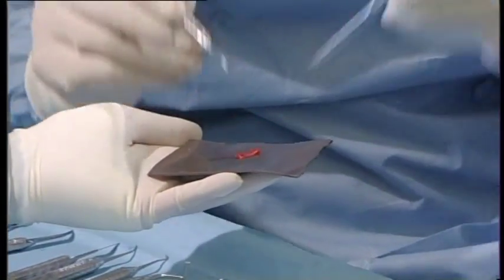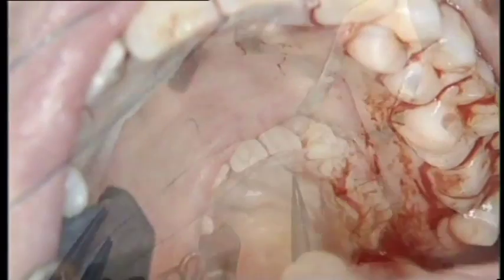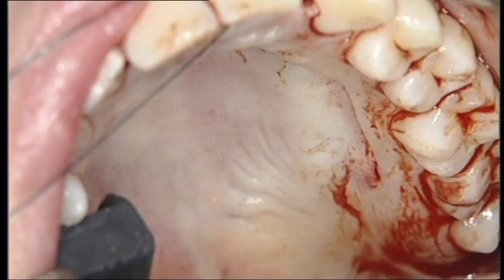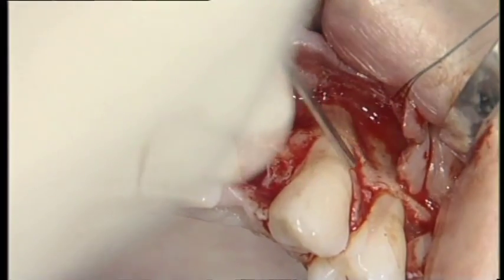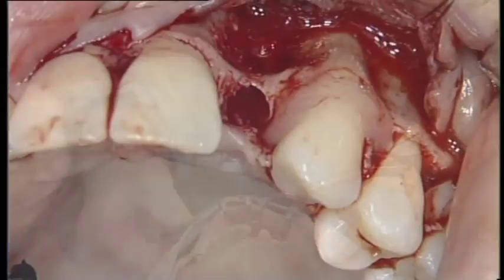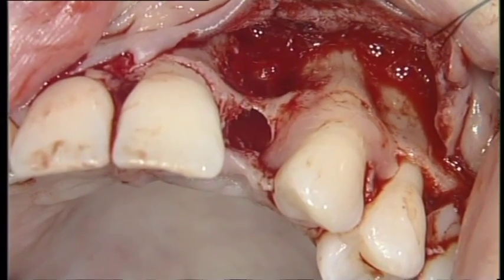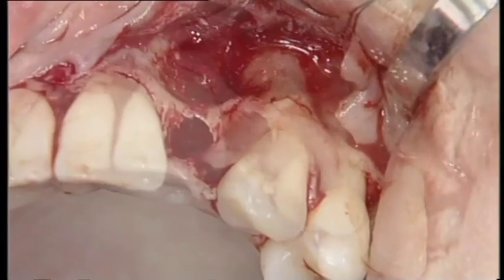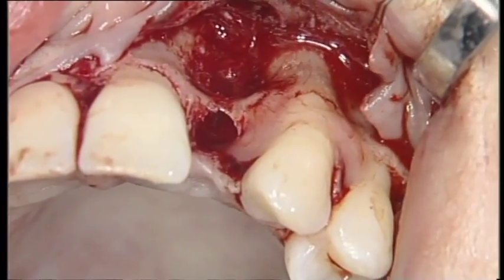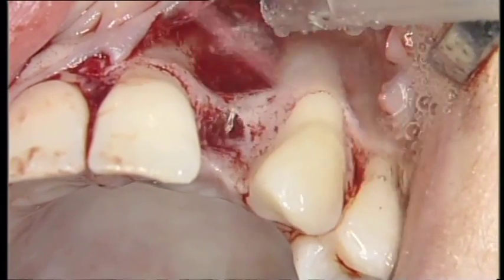The harvested graft is put on a sterile plate and moistened with saline. The clinical view shows good adaptation of the palatal flap at the donor site with the single incision technique. An EDTA gel called Pref gel is applied on the canine root to expose more collagen bundles at the root surface. After 2 minutes, copious irrigation removes the Pref gel.